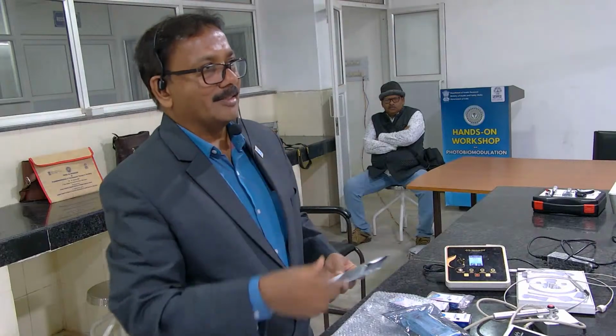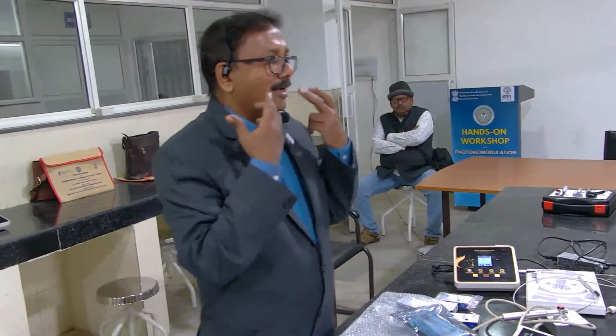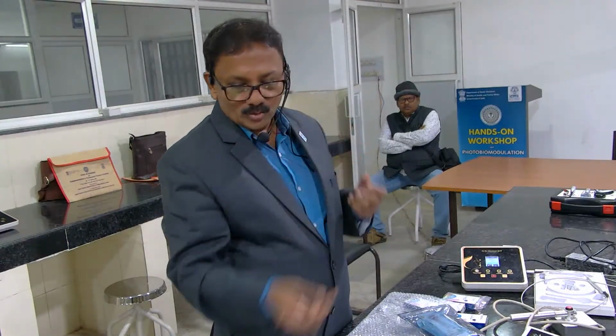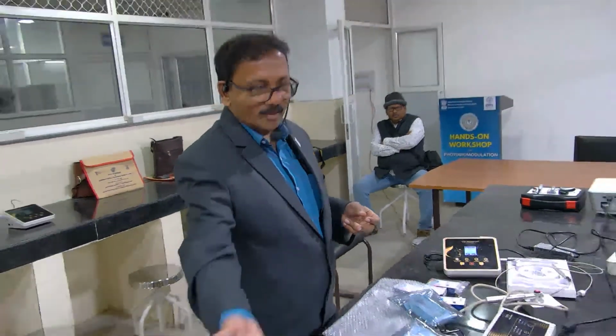For a single tooth, 8 mm. For 4 teeth at a time, if the patient comes for at least premolar to premolar, the patient expects you to do the bleaching, right? So better if you want to save time, go with the prism.